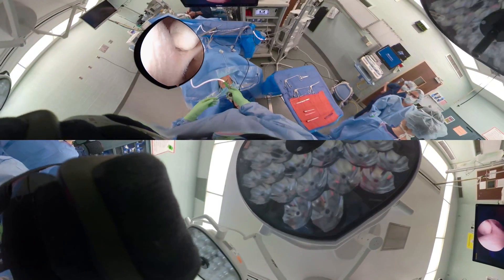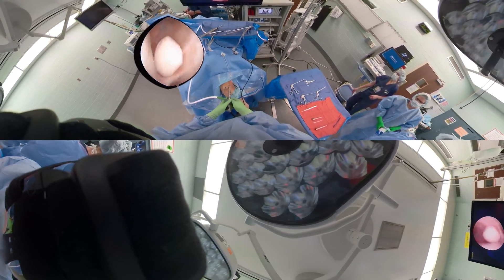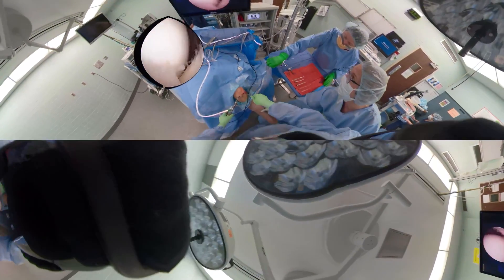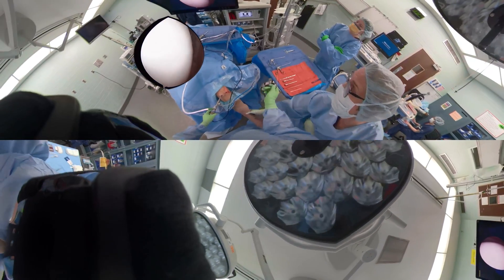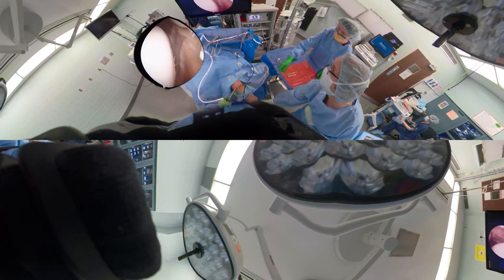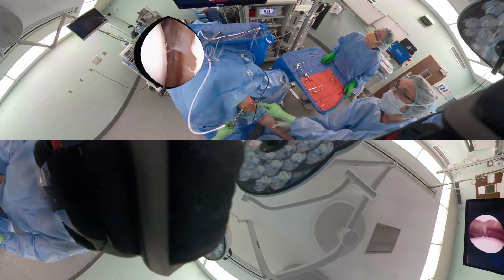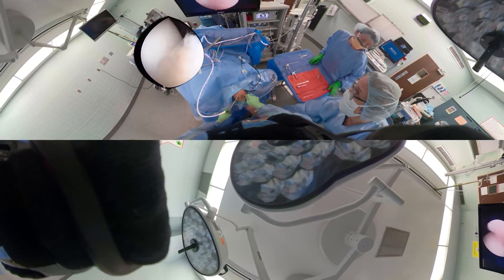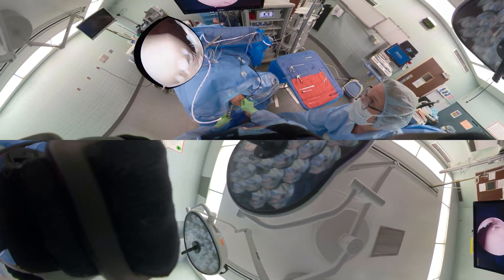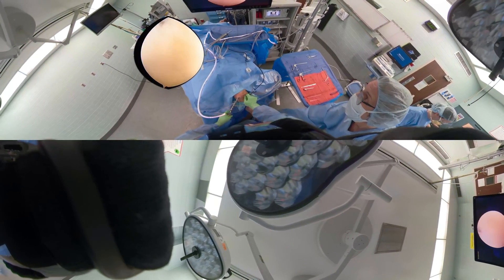We can probe from the medial portal, but we can't remove the loose body unless we switch the scope to the medial portal — so instead of that being the working portal, we're going to make that the scope portal. We'll put the scope in the medial portal and put the grasper in laterally, making a bigger incision so it's easy to remove the loose body. The rookie mistake is losing the loose body in the soft tissue because you don't have a big enough mini arthrotomy — keep your eye on the loose body.